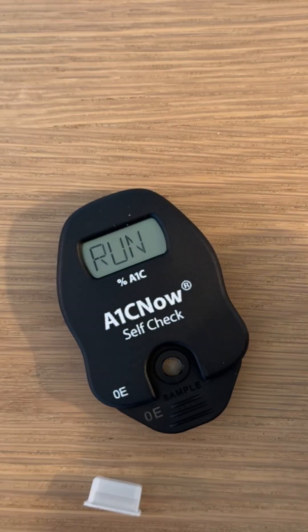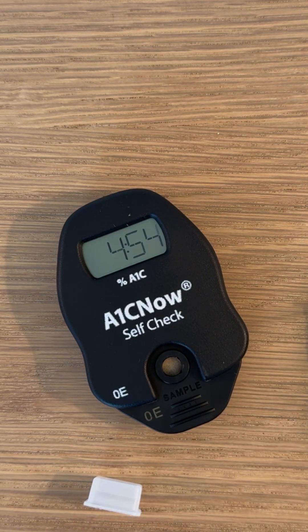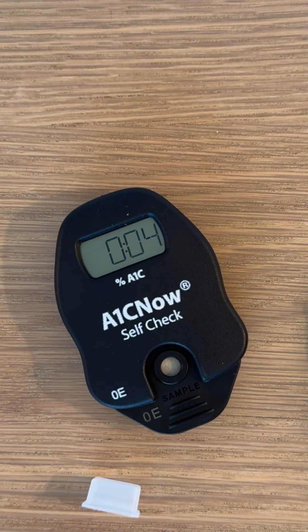It's going to take five minutes now. Let's do that countdown super fast. And after five minutes, you have your A1C result.